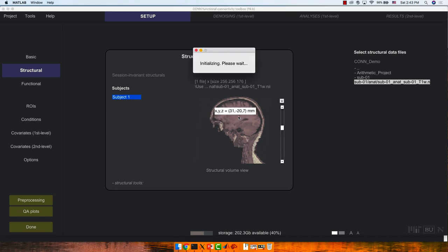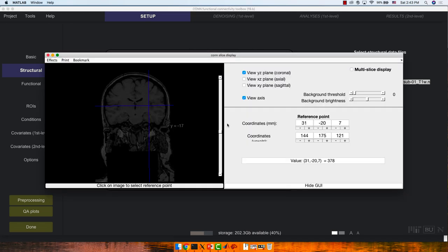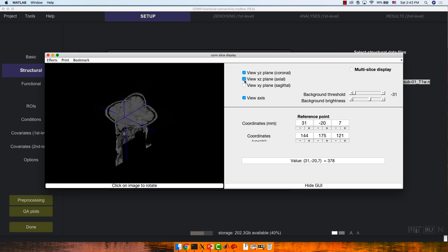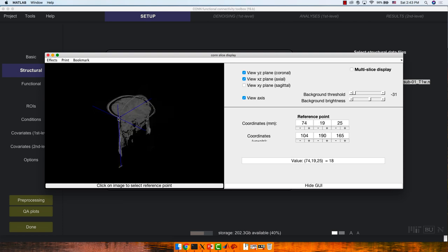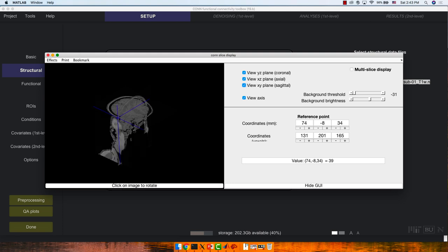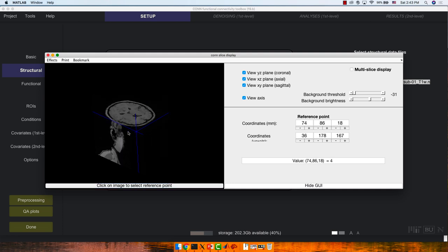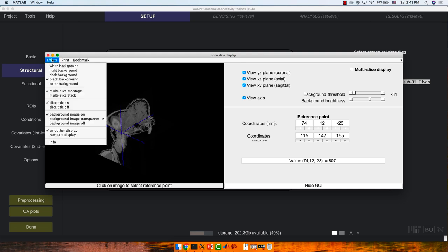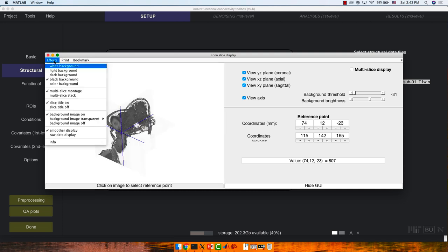If you click on the image in this window pane, it'll open up a new viewer where you can select multiple viewing planes. You can get used to looking at multiple planes, set a different reference point, and scroll through it. There are so many options — if you want to make a figure, you can do different effects like white or black background.